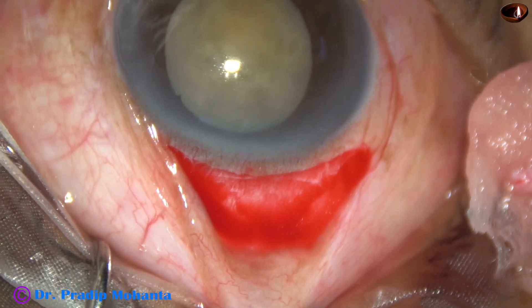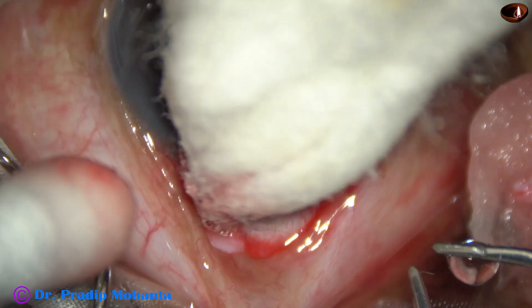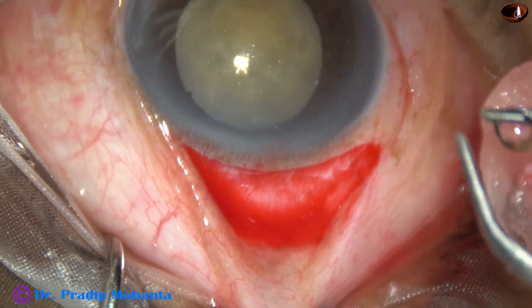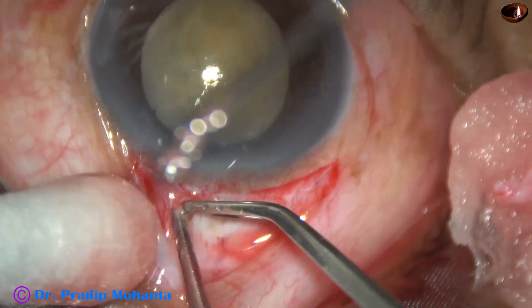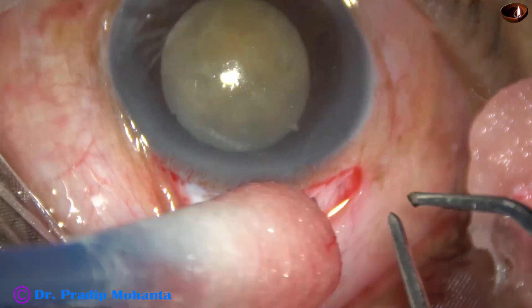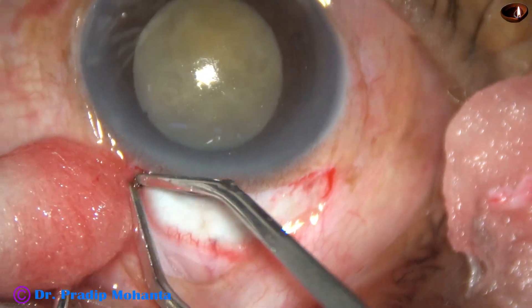My plan in this case is to do a small incision cataract surgery — not phacoemulsification — because the zonule may be weak and there is a lot of risk in such cases for doing phacoemulsification. Yes, it is possible to do phaco, but SICS is definitely a safer option in such cases.